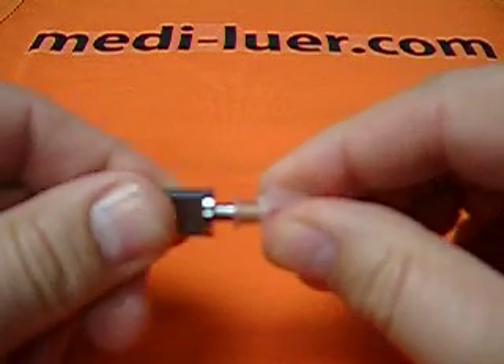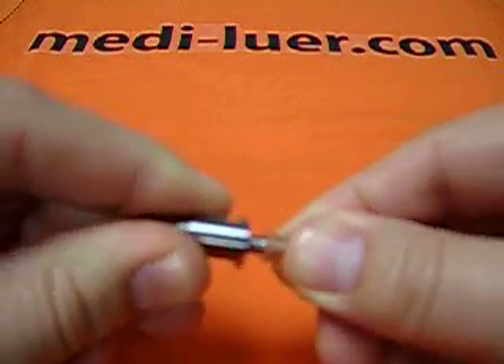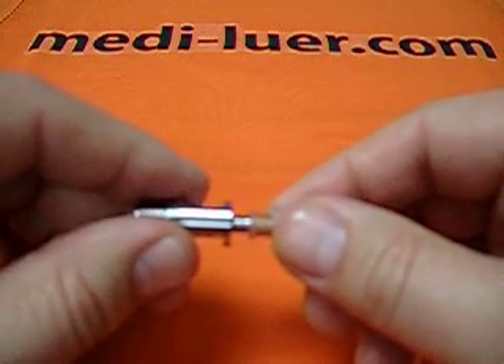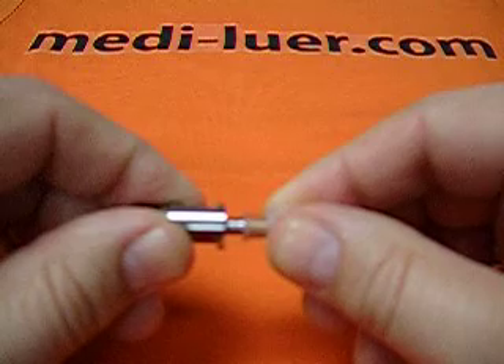Basically, what this is doing is saying that a relatively light amount of force and a relatively light amount of torque have to be applied at the same time. And if we overdo the pressure or overdo the torque, we're going to invalidate our test.